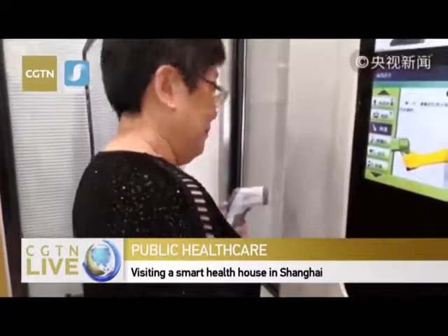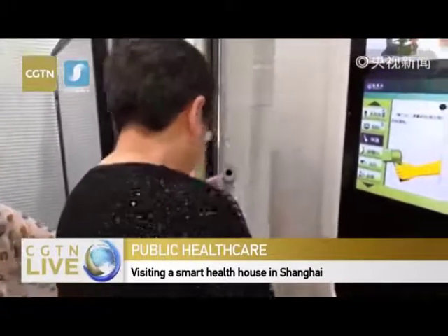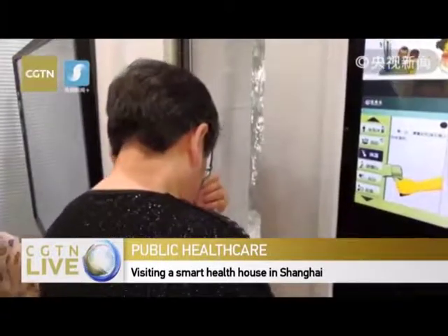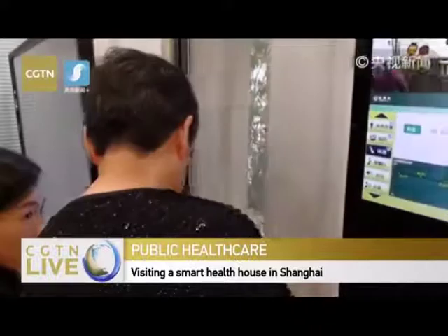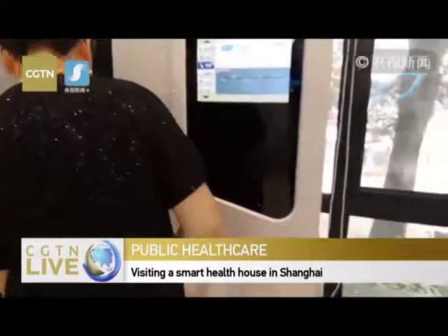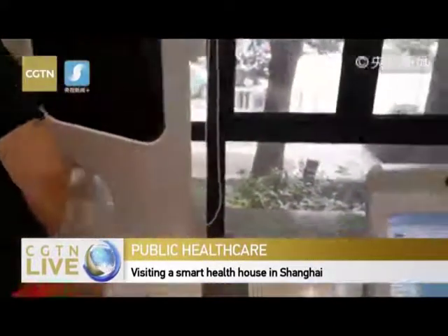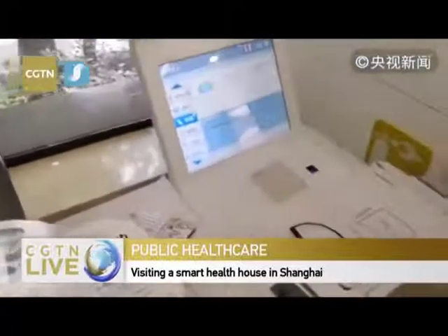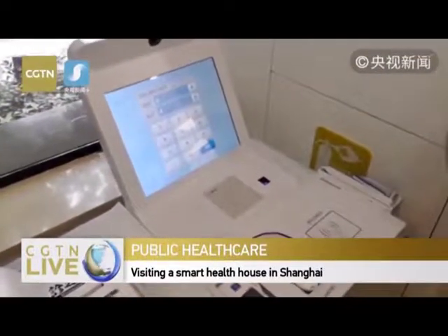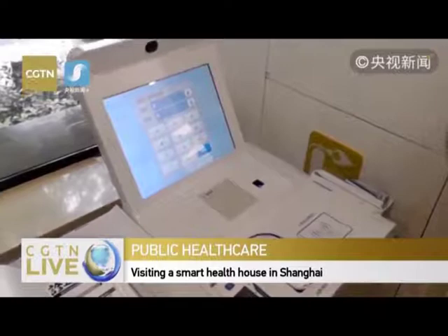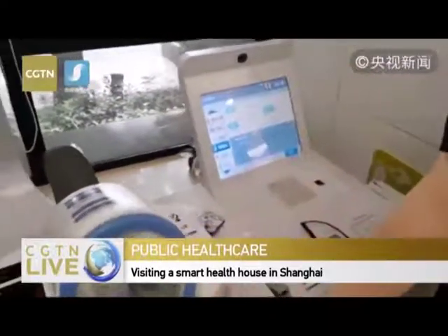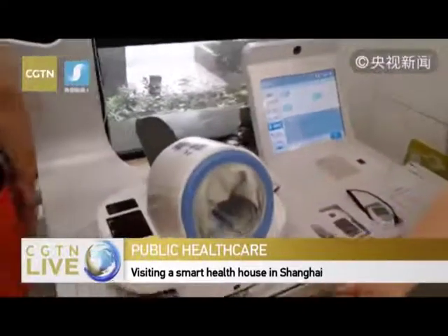Right now we're testing her body temperature. You can see it's very fast — just one click and we can get a number, within just two seconds.